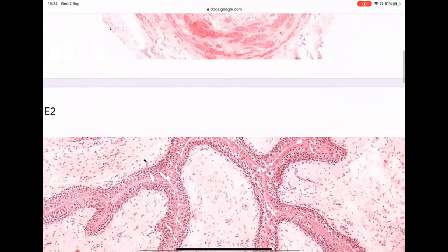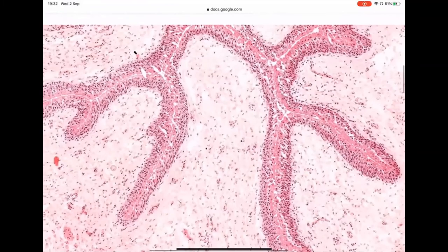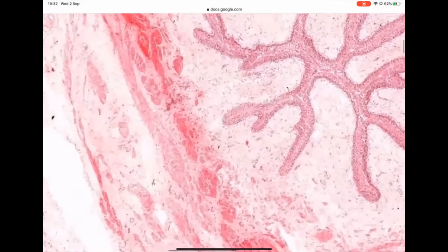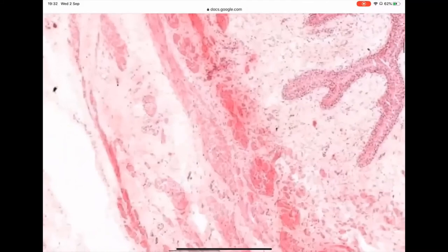Because don't forget that in here, what we need to appreciate and decide is if we have a CIS, or if we have a cancer, or if we have an invasive cancer, or sometimes you might find some nests just sitting in the muscle. Okay, so this type of frozen section is characteristic of the problem of urothelial carcinoma. When urothelial carcinoma spreads and presents itself, it can have these satellite lesions, okay? And these satellite lesions can present even in the adventitia, okay?